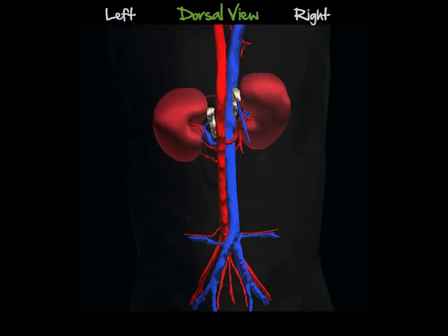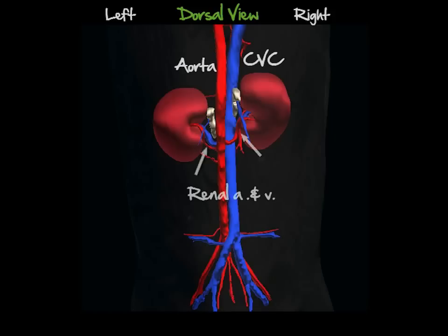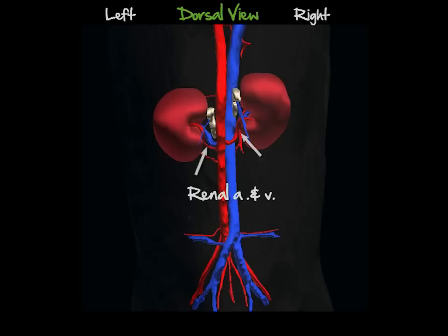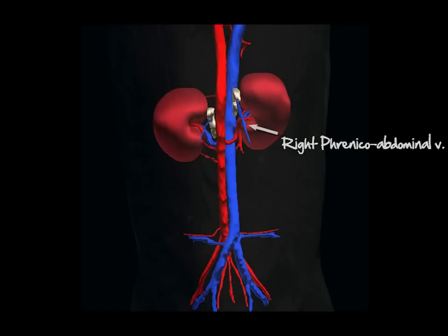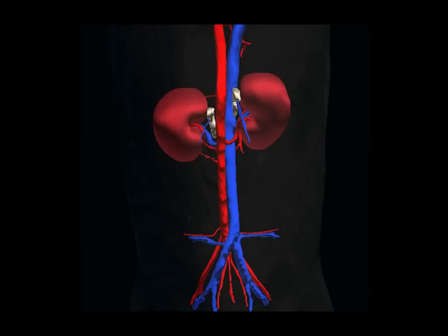In this dorsal view, we can appreciate the anatomical relationships between the adrenals and the neighboring vessels, namely the aorta, caudal vena cava, and renal arteries and veins. The phrenicoabdominal vein is on the right side, and it also divides the right adrenal into two lobes.